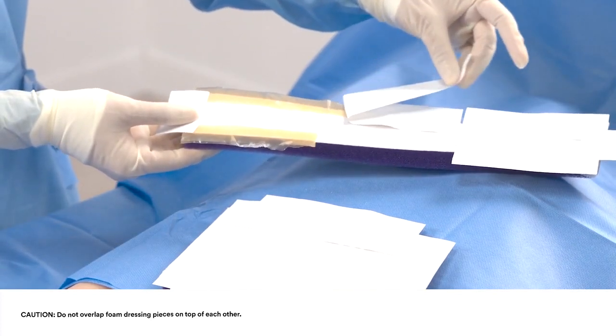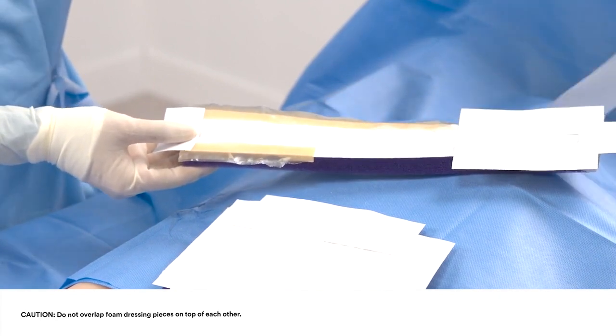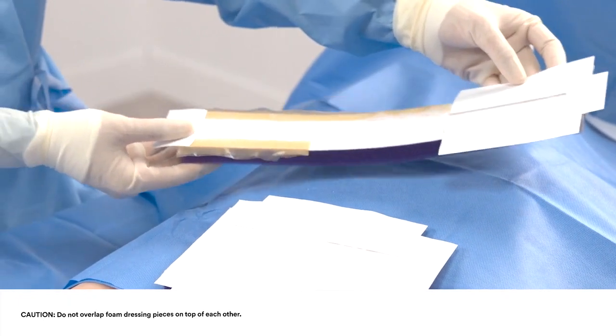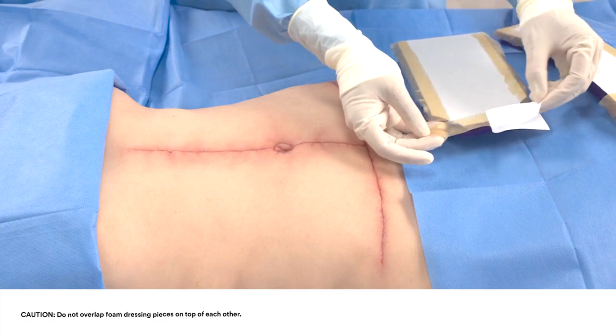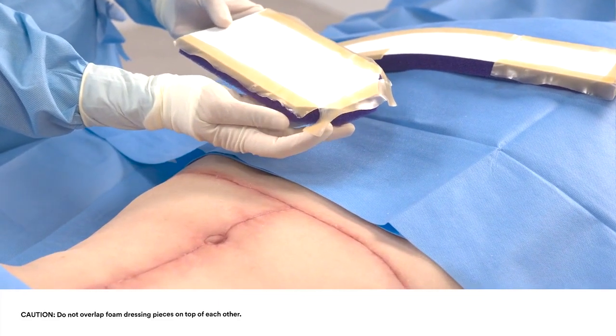The strip should be placed half on the dressing and half off the dressing, and overlap the adhesive seal on each side of the dressing. This ensures a seal all around the edge of the dressing. Remove the remaining liner from the sealing strip. Repeat strip application around the foam dressing as needed.